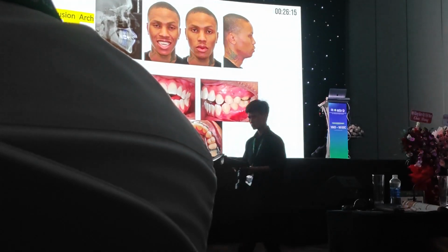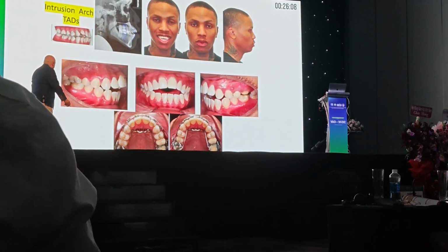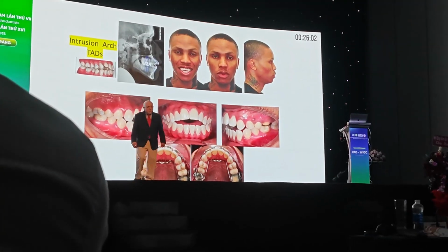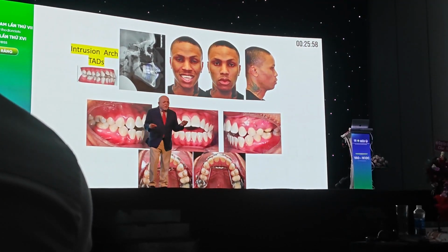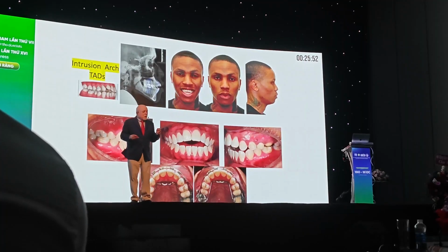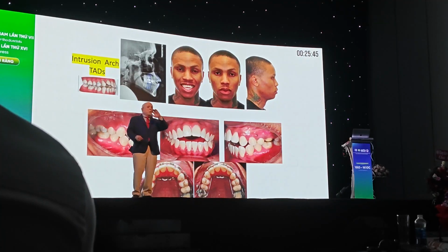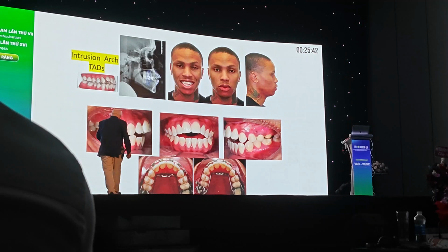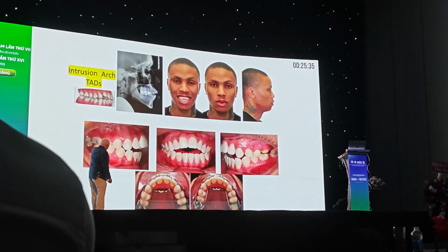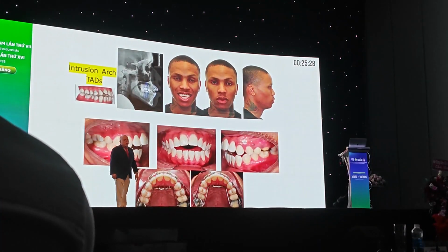Take a look at this patient. Skeletally, there are no issues. He looks fine. Soft tissue-wise, there is a problem. Dentally, there is a problem. There is an open bite. Now, you don't want to change the posterior occlusion because it's pretty good. So Dr. Uribe started calling this targeted mechanics. You know, the terminology comes from medicine because these days in medicine, there are a lot of medications which are targeted, that you want to take care of the cancer, but you work with the cancer instead of doing the whole medication systemically. So instead of putting brackets on all these teeth and putting a wire and all that, having side effects, the idea here is keep the posterior the way they are. Put a TAD here, indirect anchorage, and from the TAD, apply the force to move the teeth.